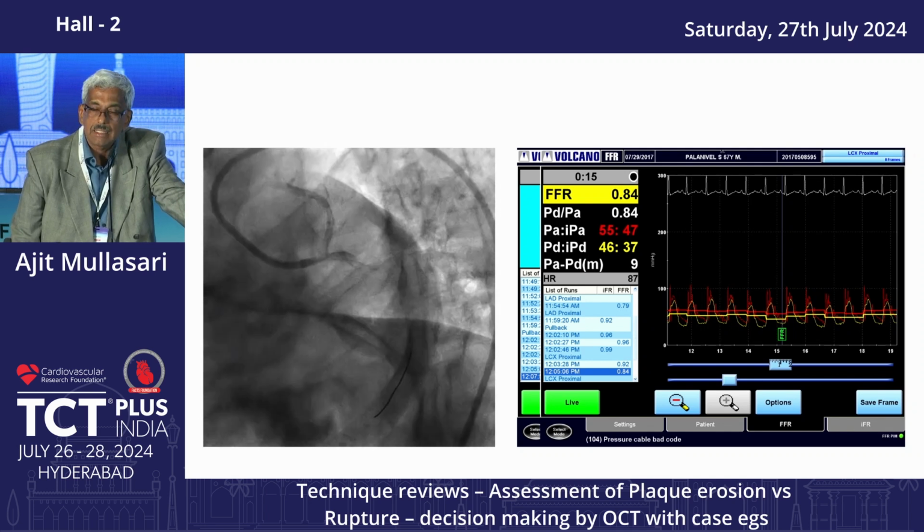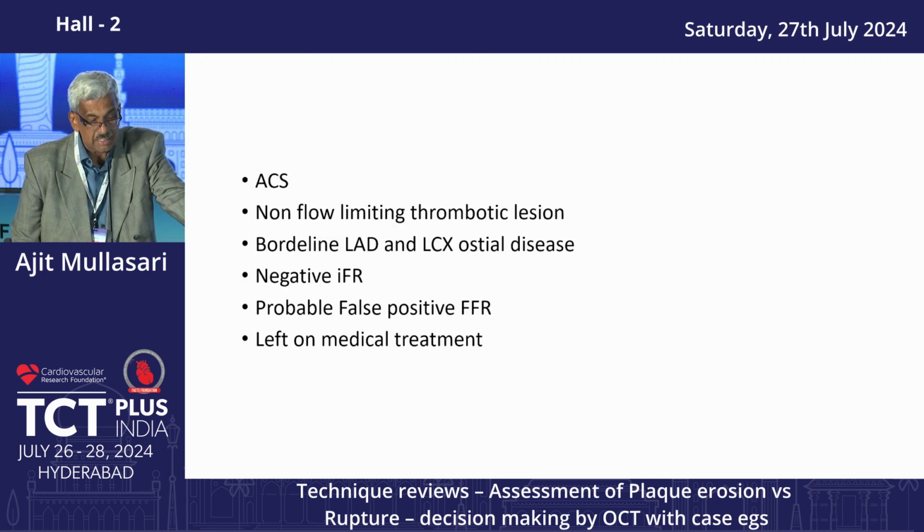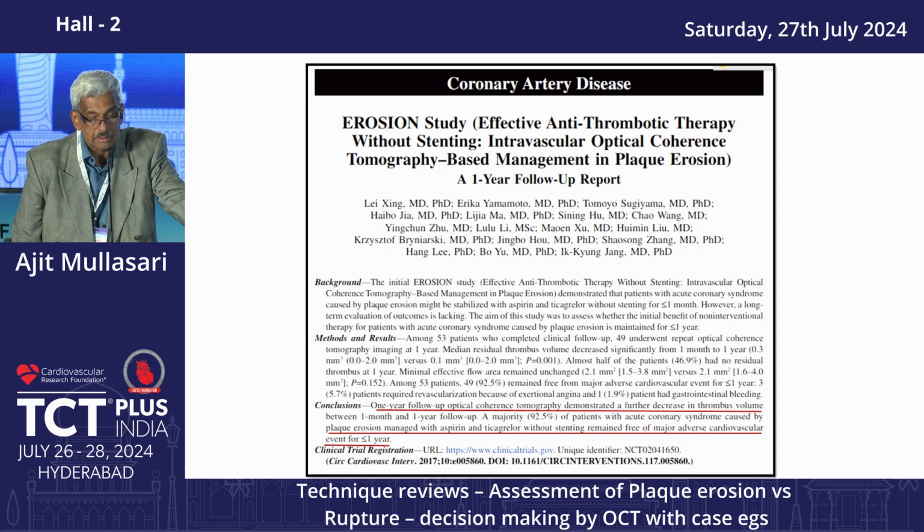The patient presented with ACS, treated medically. So many of these patients, you don't need to interfere if there are no flow-limiting problems, especially when imaging in the acute state shows good flows and good lumens, and later on you do your functional testing, and you can leave the patients on medical treatment.